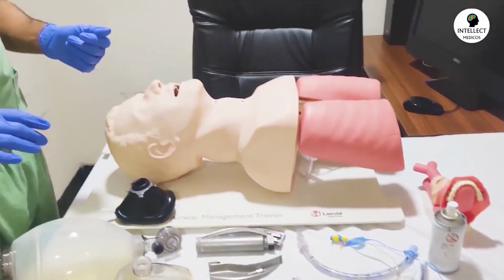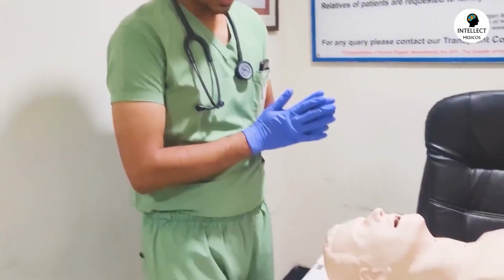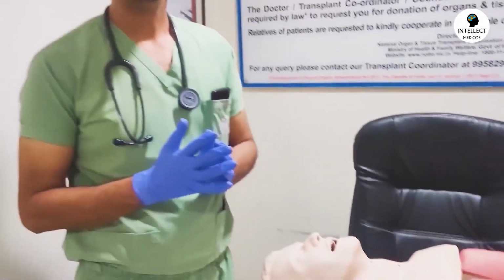Coming on to the procedure, how to perform it. First of all, you need to take all the universal precautions. That means you need to wear gloves and a mask. And now we are working in this COVID era, so wearing a mask is mandatory before performing any kind of procedure, before intubating or even bag and masking, you need to have your mask.